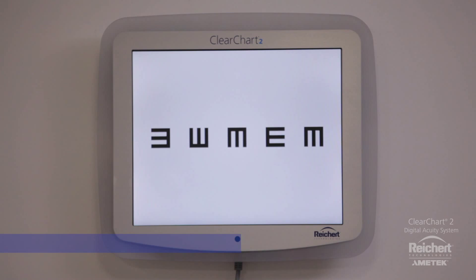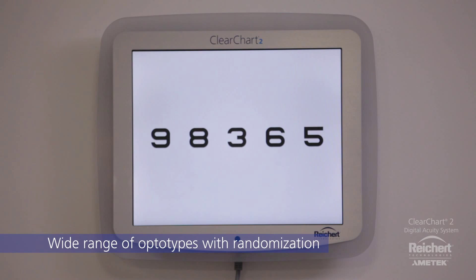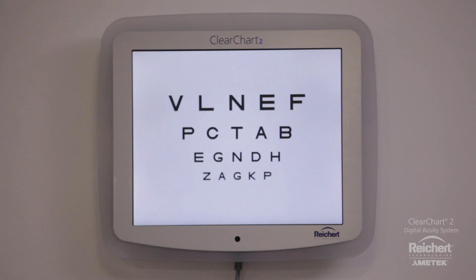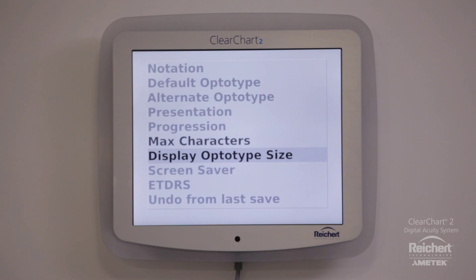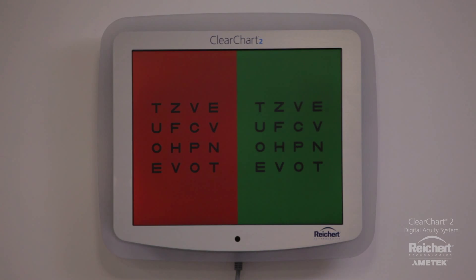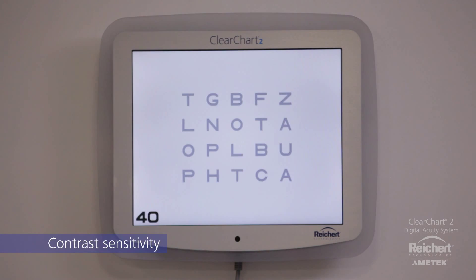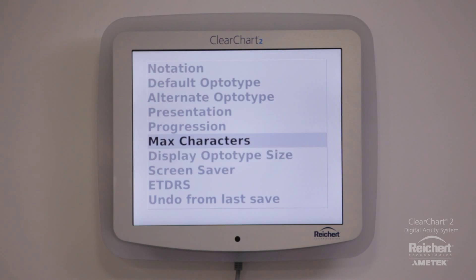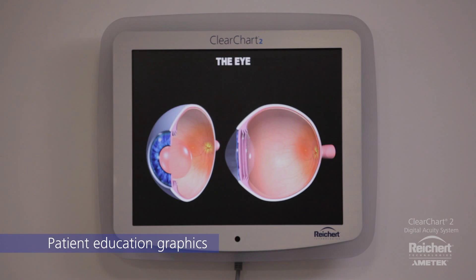ClearChart 2 is packed with a wide range of optotypes that can be easily randomized to prevent patient memorization. Optotypes can be displayed in Snellen or LogMAR progression. It also features an extensive library of additional tests, including contrast sensitivity, pediatric fixation, and astigmatic tests. ETDRS test mode and patient education graphics are also included.